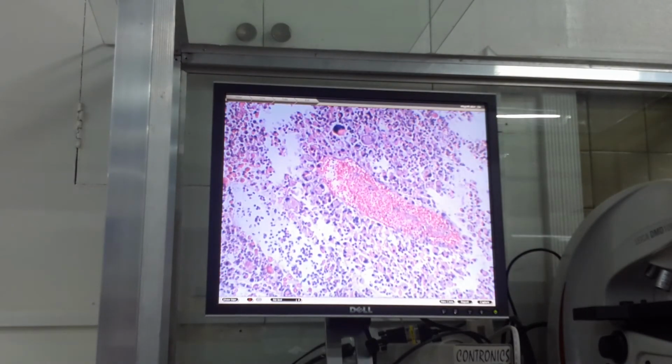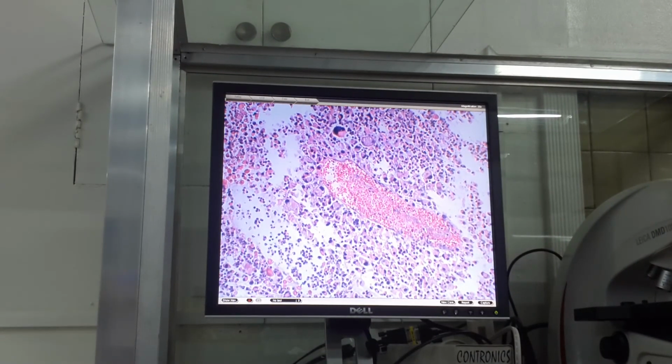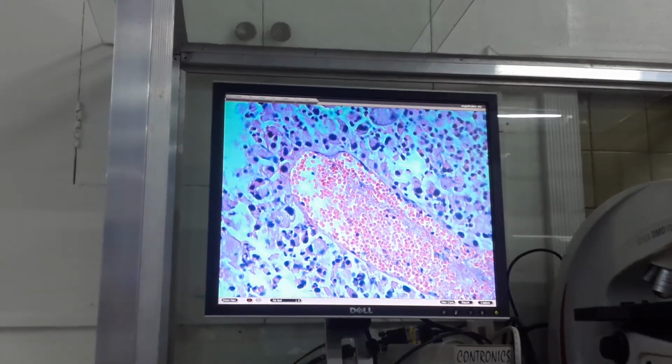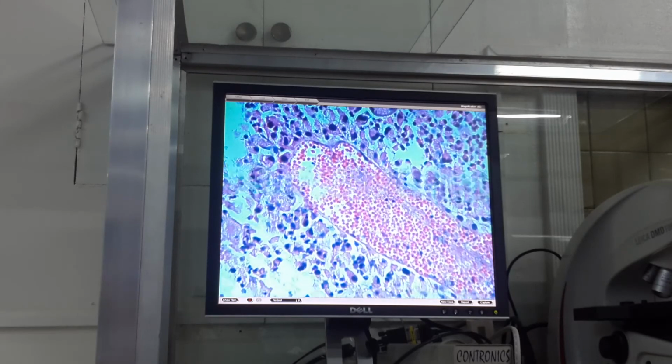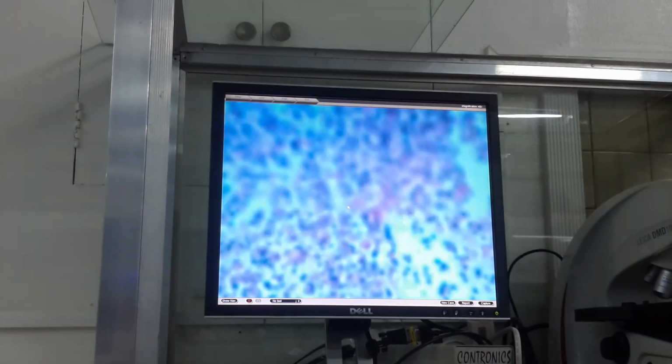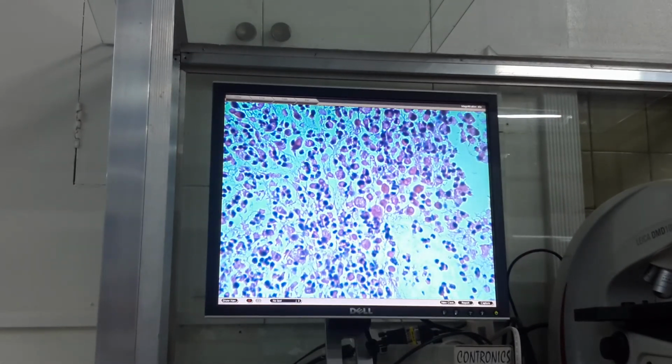Is it benign or malignant? It is malignant because it shows pleomorphism, hyperchromaticity, increased nucleocytoplasmic ratio. What is the other characteristic which points to the tissue of origin? Red blood cell po dyan. O, anong nahahalata nyo? Anong marami siya? Anong marami yung cell? Mayaman siya sa kulay red. Meron siyang eosinophilic cytoplasm na marami, di ba?